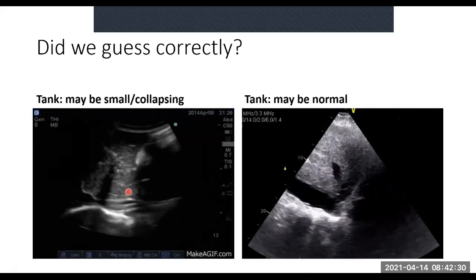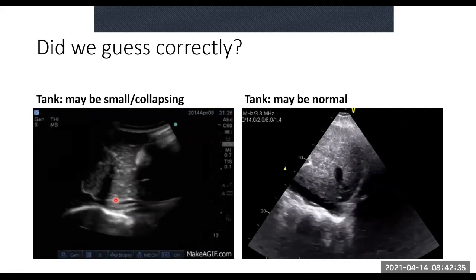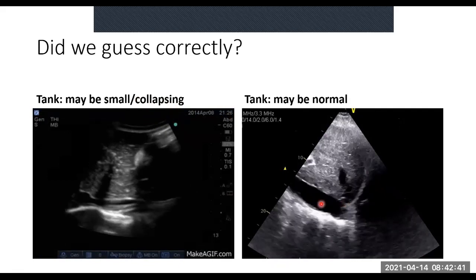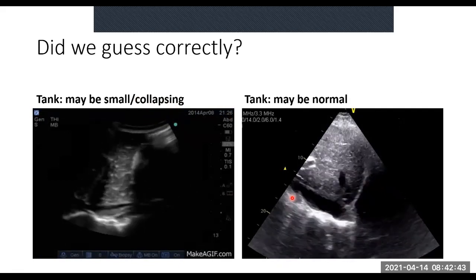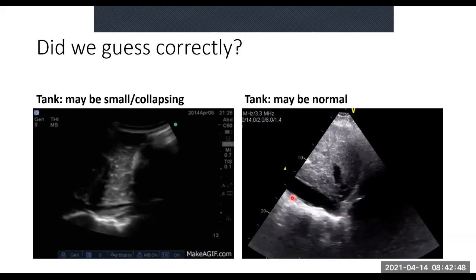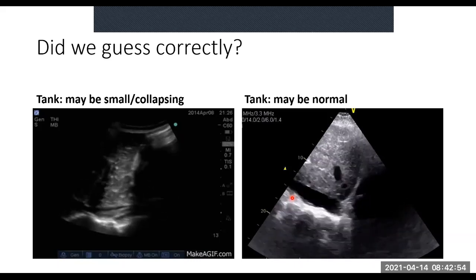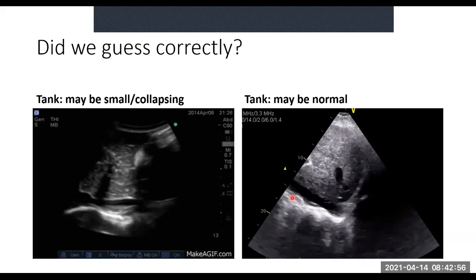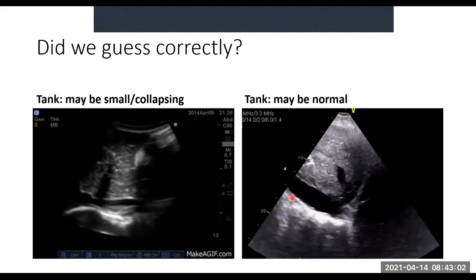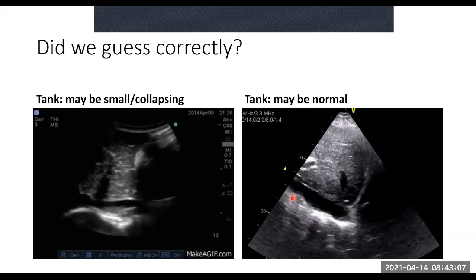And then, surprisingly, the IVC may be small to collapsing, all right? And sometimes it may be normal, okay? The reason for that is actually the heart itself. Because remember, the IVC is actually dependent on the right ventricle for its collapsing and things like that, right? So you would rather look towards your peripheries. Not necessarily with ultrasound, but clinically. So what do you expect to find clinically? Edema, that's for sure. Anything else? Especially in pediatrics, they talk about this.